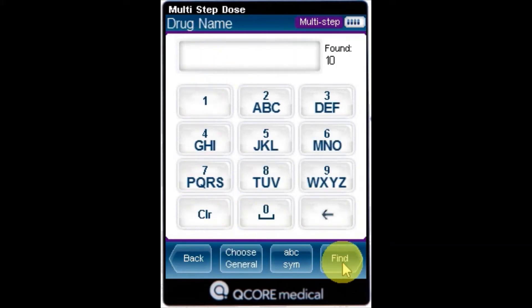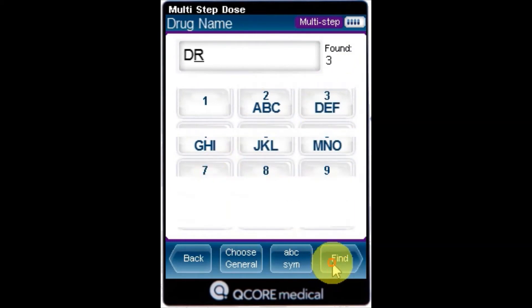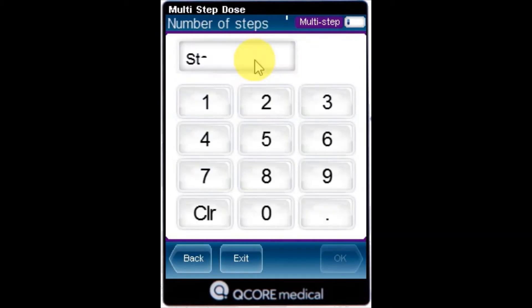From the Drug Name screen, using the keypad, enter the drug name and then press Find. From the Drug List screen, select the row of the relevant drug.